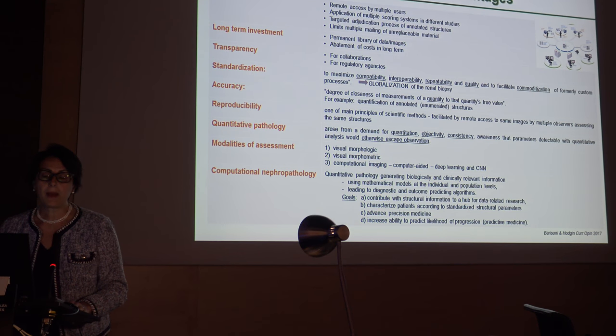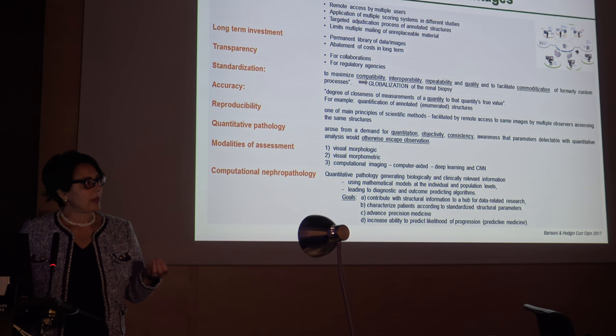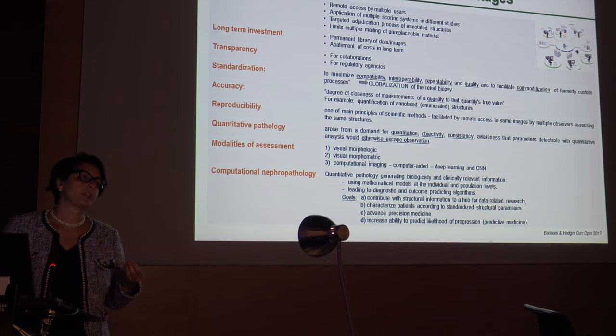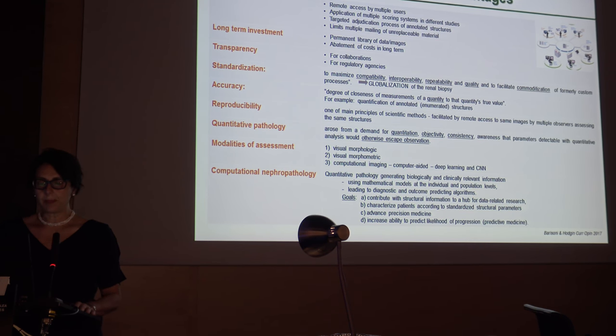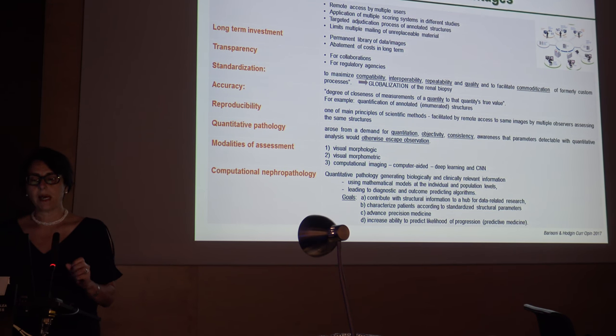And to apply quantitative pathology: if you think about how we practice pathology, our pathologic diagnoses are qualitative. They are holistic processes. The use of digital pathology actually helps us add more numbers to our interpretation. The demand for quantitative pathology arose from the need for quantitation, objectivity and consistency. And this is a very important point: awareness that parameters detectable with quantitative analysis would otherwise escape our attention. Digital pathology also allows different modalities of assessment, from visual morphologic and morphometric to computational imaging.